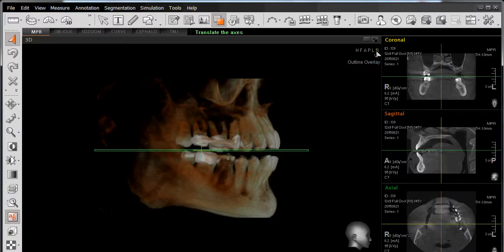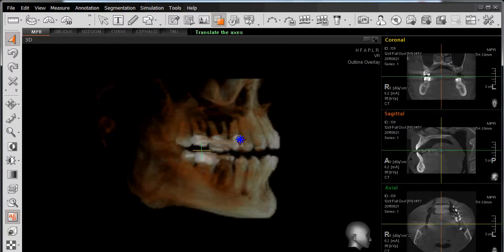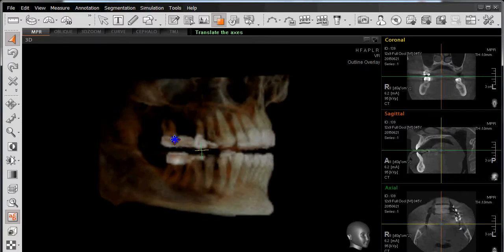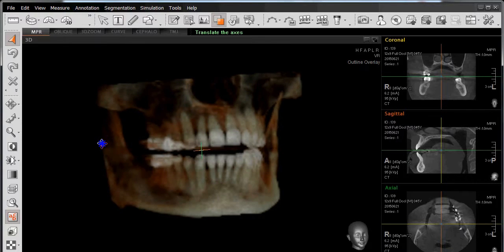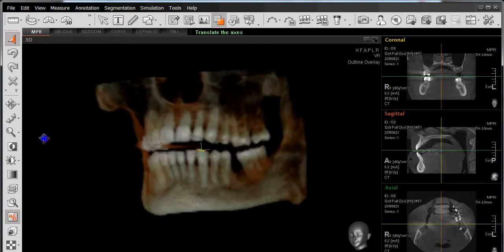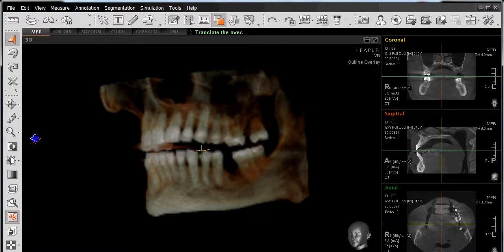We also have the ability to do a freehand rotation. To perform this task, simply position the mouse on top of the anatomy, right-click with the mouse, and in this case, going from right to left, we'll rotate the image around to look at the left-hand side of our arch.